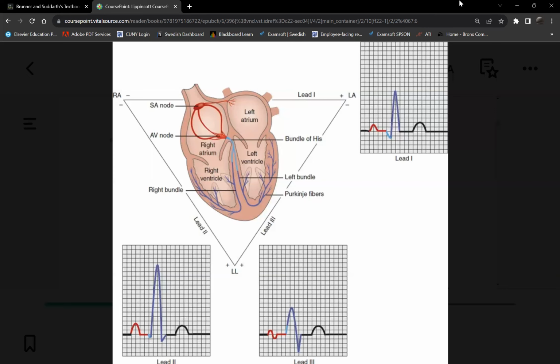So this is the protocol. Whenever you have a patient complaining of chest pain, that's always suspicious for a heart attack, or any form of ischemia. So we put on an ECG. You of course notify the physician, but you know the physician's going to order a 12-lead ECG anyway, and it's your patient. So you want to facilitate the diagnosis. You put them on while the doctor or the rapid response is coming. You can get the order later. We just put it on because we know from experience they can order it anyway. It's your patient, it's still your problem.